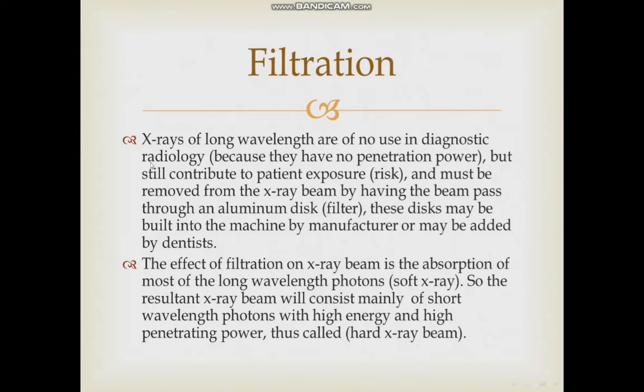Filtration. X-rays of long wavelength are not needed in diagnostic radiology because they have no penetration power, but still contribute to patient exposure risk. They must be removed from the X-ray beam by having the beam pass through an aluminum disc. These discs may be built into the machine by the manufacturer or might be added by the dentist. So the function of the aluminum disc is to filter out the long wavelength because they don't have any penetrating power.